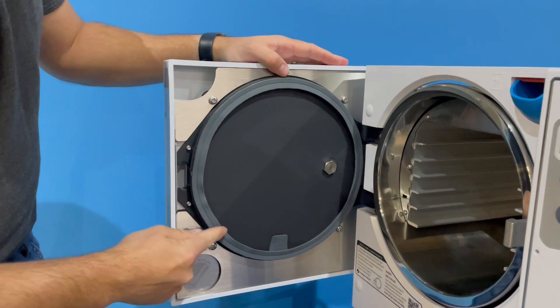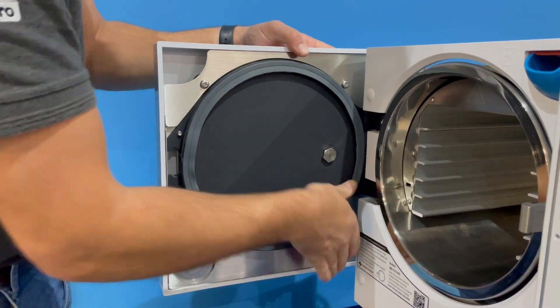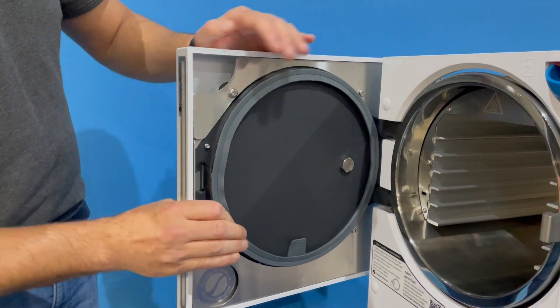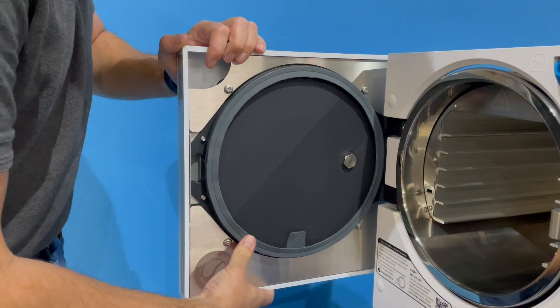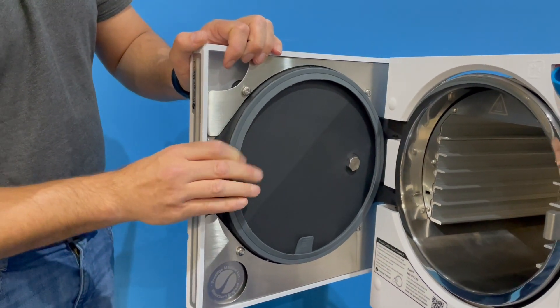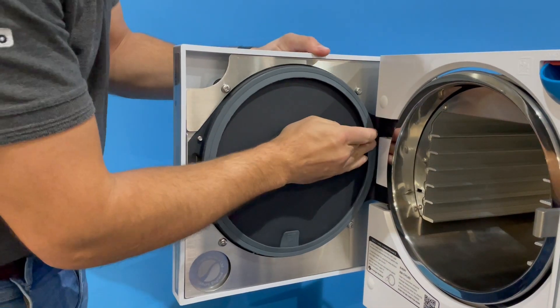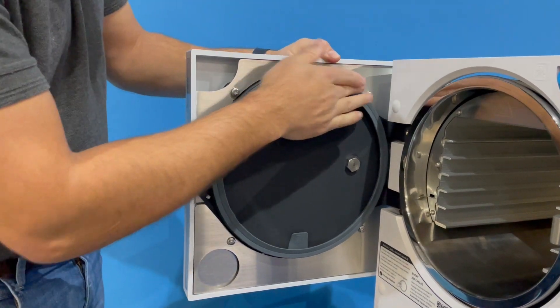You'll notice some areas of the gasket will ripple slightly, but this isn't an issue. Just take your time, making sure that you've pushed the entire gasket in all the way around. You'll see that it will eventually start smoothing out. Check all the way around inside that it is all level and flat.